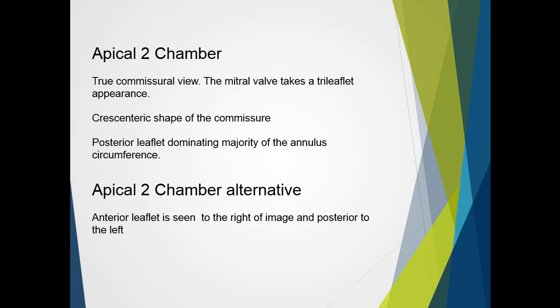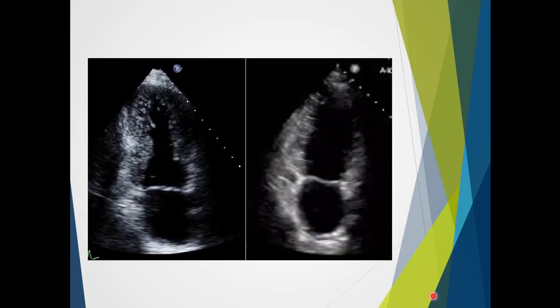The anterolateral papillary muscle is removed by rotating counterclockwise, and then we see the anterior leaflet on the right of the image and posterior to the left. This is an oblique view obtained through the mitral valve, showing the inferior wall and the true anterior wall. We can see both papillary muscles associated with the commissure view — the medial portion of the posterior leaflet, the mid portion of the anterior leaflet, and the lateral portion of the posterior leaflet. As we rotate further, we lose the anterolateral papillary muscle and the valve assumes the typical two-leaflet view again.